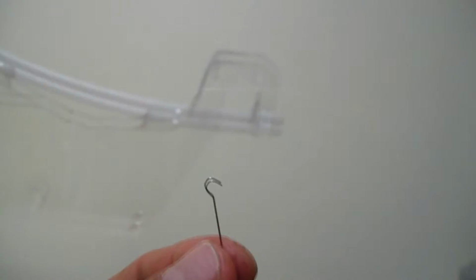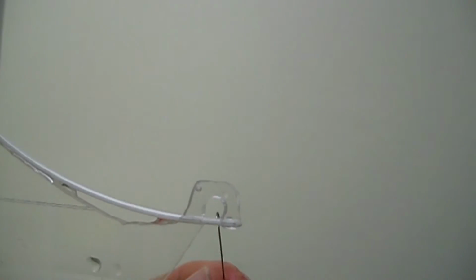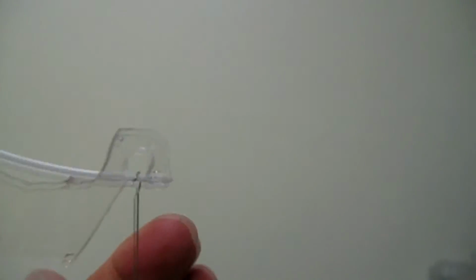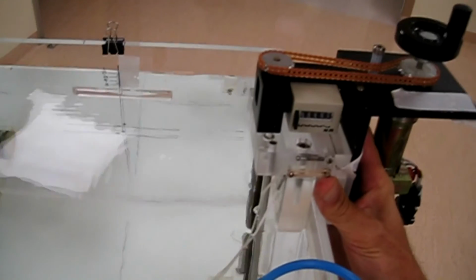The headpin device was made of a steel needle mandrel. It hangs on the catheter using a special wire device. All this build-up I am immersing into the water tank, taking care about tightening of the screws.